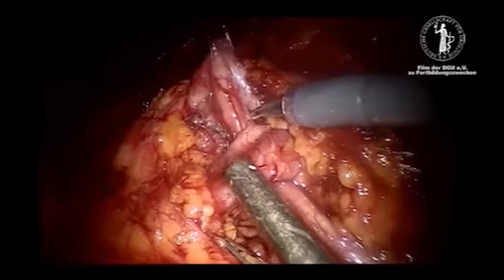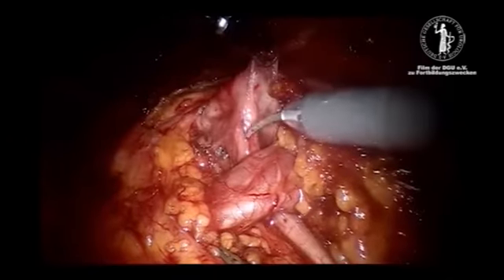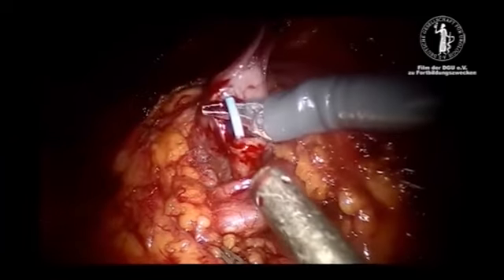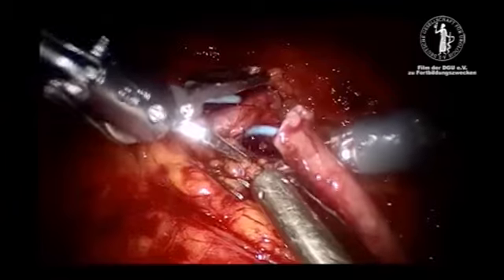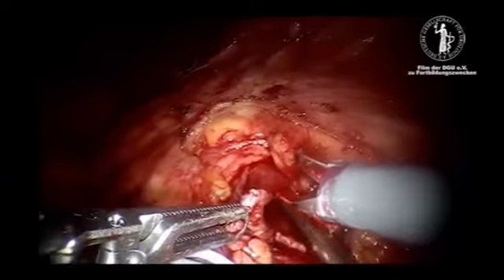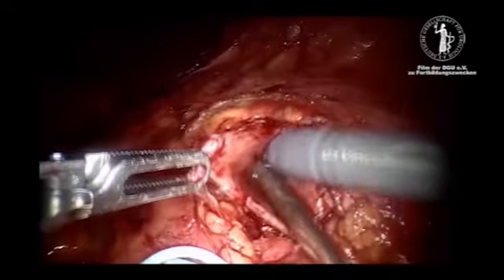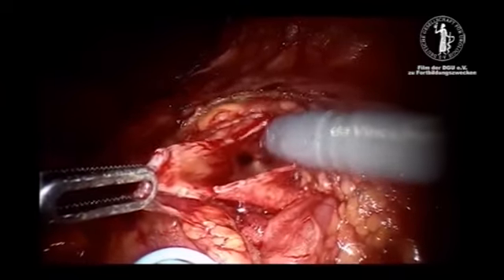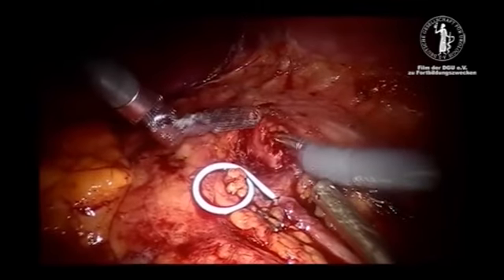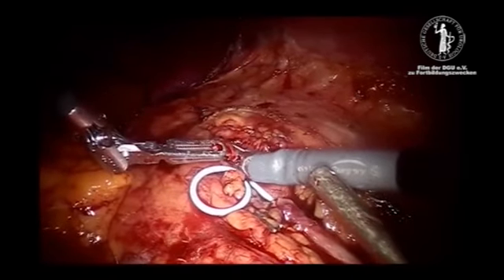The UPJO is mobilized from the vessel pair and transected. In this case, the enlarged lower pole renal pelvis is incised on the ventral lip. The aim was to preserve the vascularization of the proximal ureter that runs alongside the posterior lip. For the same reason, only the ventral lip is resected to reduce the size of the renal pelvis.